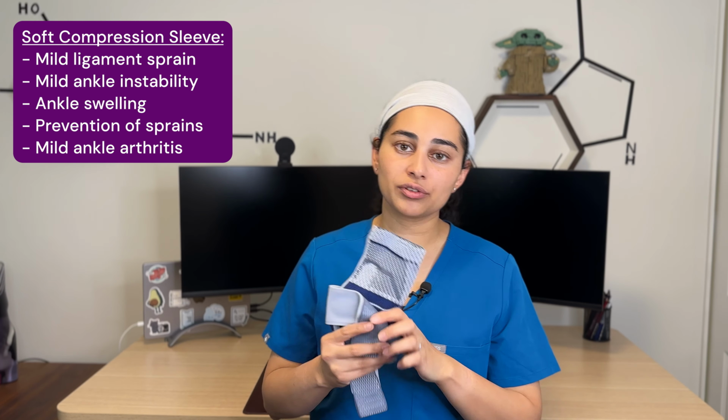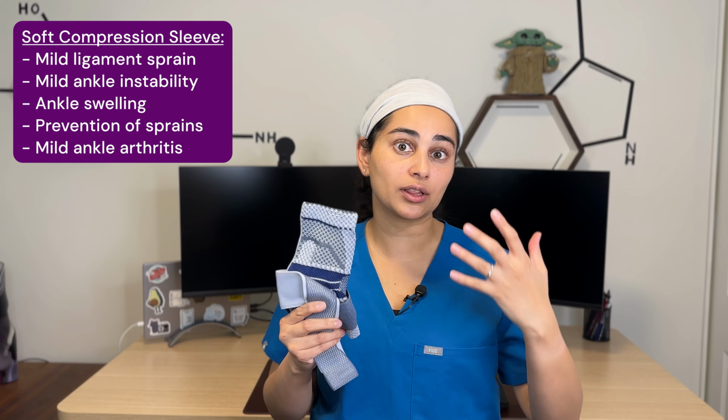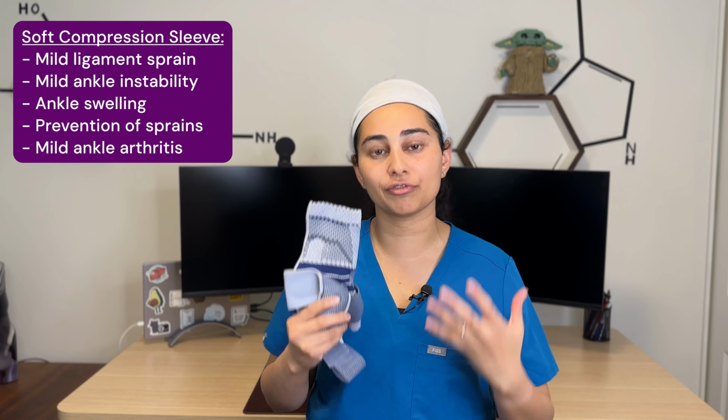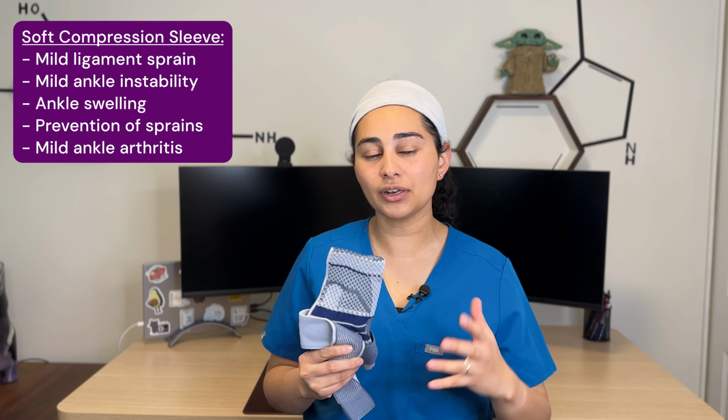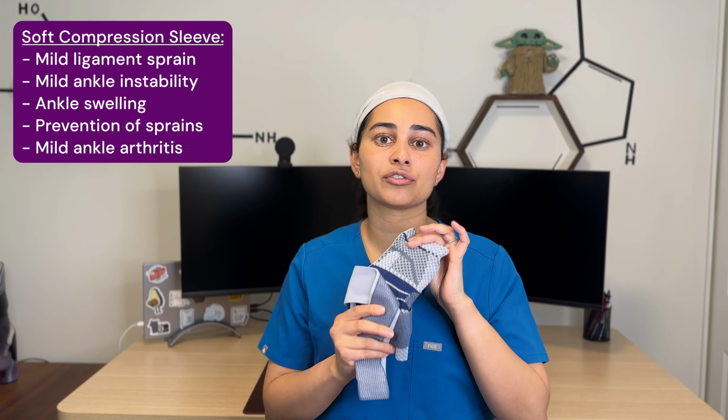A lot of patients will use this as a prevention. So if they're playing a lot of basketball or soccer and they want to help prevent having ankle sprains because those sports are riddled with a lot of ankle sprains, they'll end up using this during their sport.